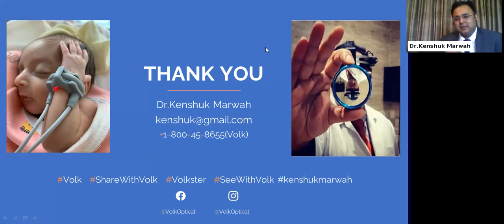Secondly, my personal favorite is a pan retinal 2.2 for a wider field. So, for the BIO, I would prefer a 2.2, and for the slit lamp, I would start with a 90D. But if going back, I would have got the 78 diopter lens in my second year of residency, because that 90 diopter gives a much wider field of view, and this lens, the digital wide field, or a 66 diopter or 78 diopter, you choose whatever you want to choose.